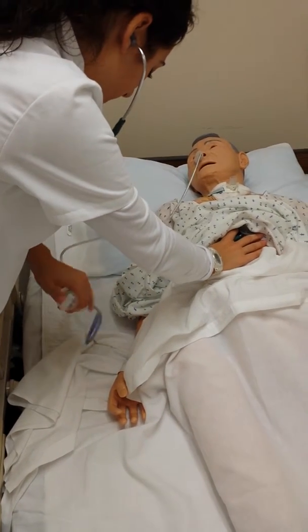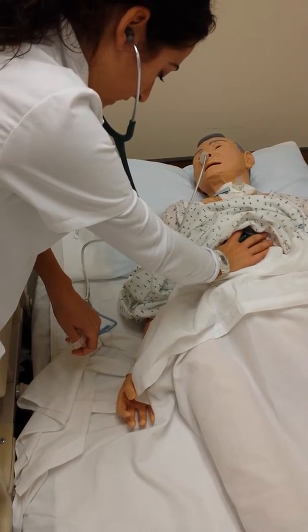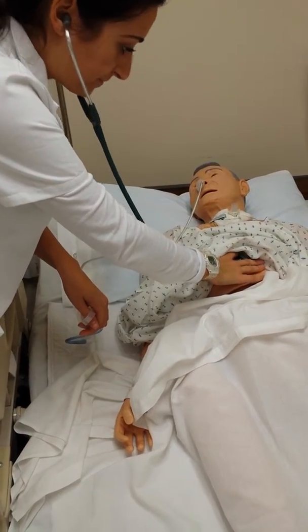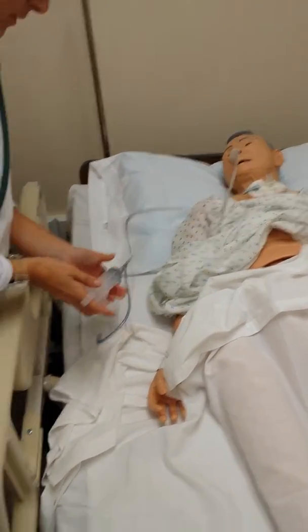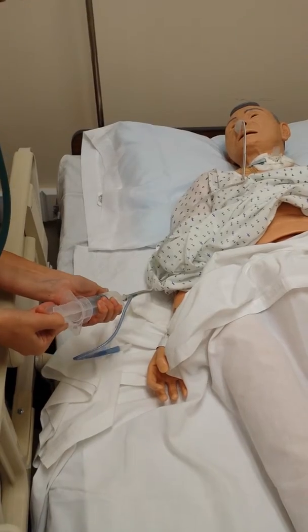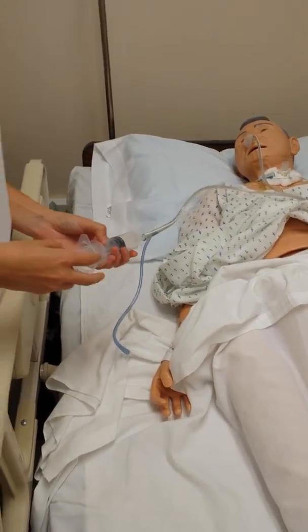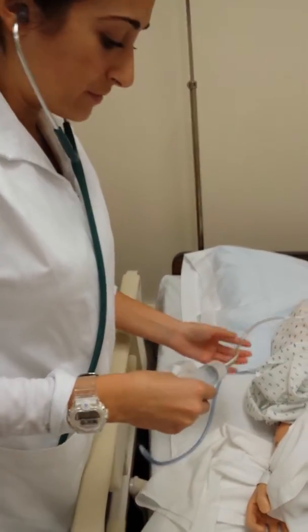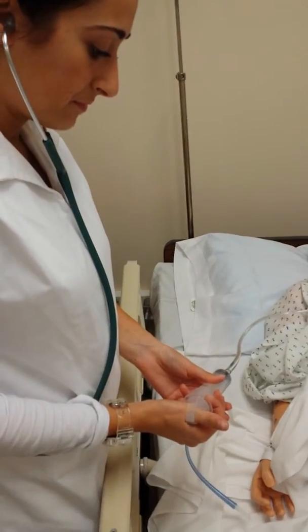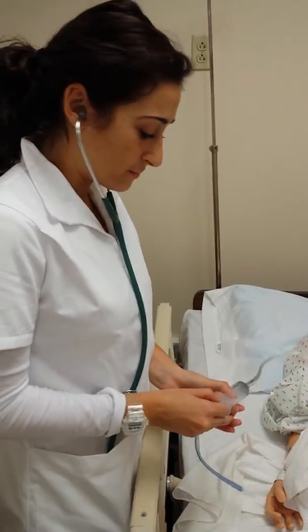Once we do that, we're going to push in this 20 to 30 cc's of air, and you want to hear a bubbling sound when you push it in by the xiphoid process. After we do that, we're going to pull back and check for residual. You pull back 25 cc's — anything under 100, you're going to push back in; anything over 100, you're not going to push back in and you would get a doctor. Since it's 30 cc's of residual, we're just going to push it back in.